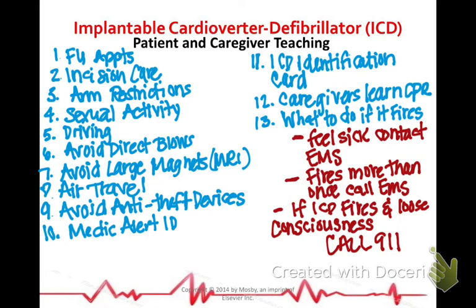If it fires more than once, call EMS. If it fires and they lose consciousness, it's an emergent thing, so definitely call 911, EMS. So that's the big difference.